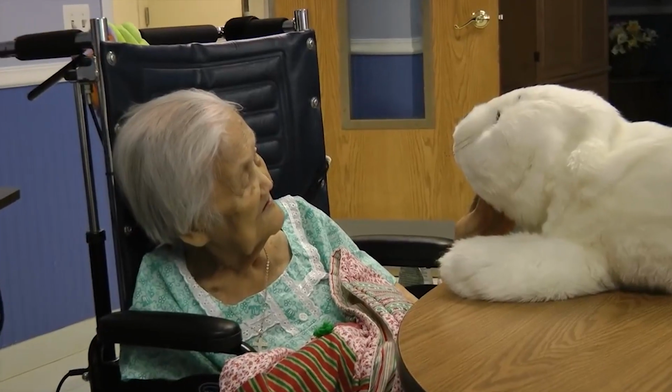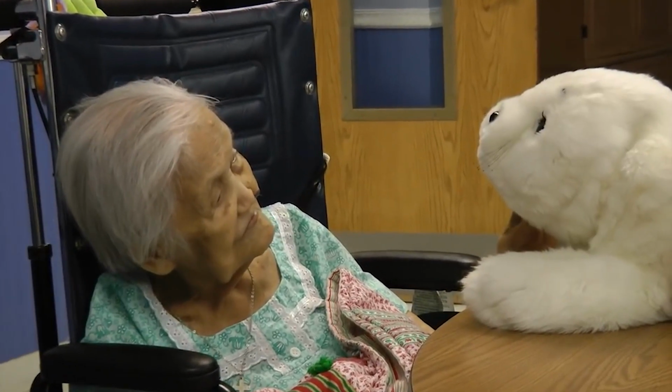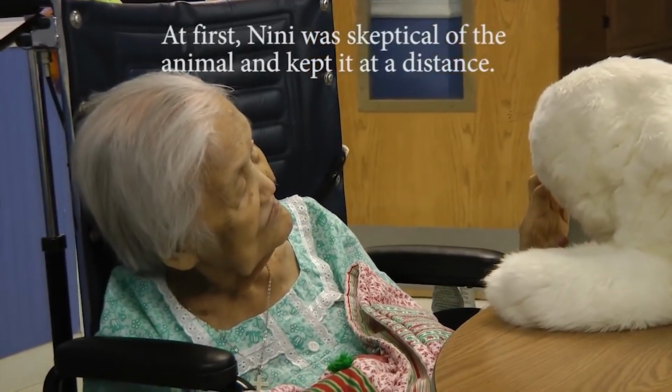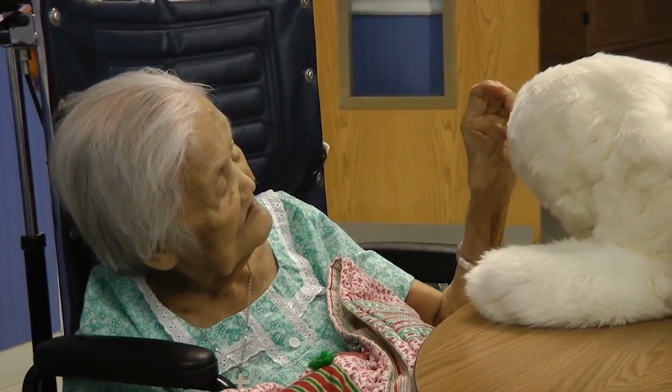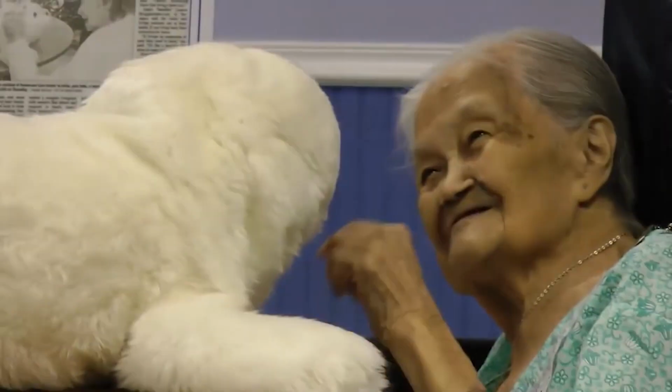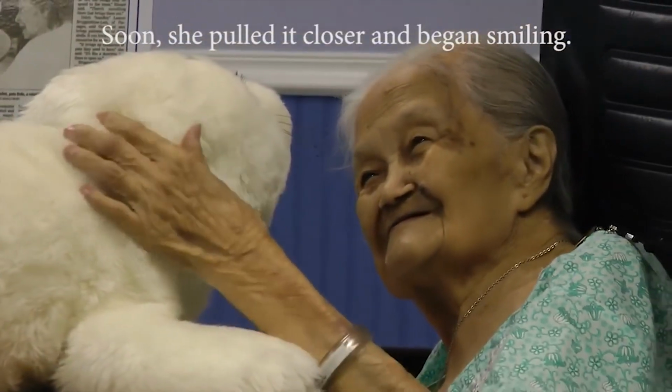The PARO therapeutic robot is an interactive device that resembles a young harbor seal and was created to mimic the therapeutic effects of animals without using actual animals. Animal therapy is a common tool for easing patient stress, but there are not always trained animals available to satisfy a current need. This is when the friendly animal-like PARO fits the bill.